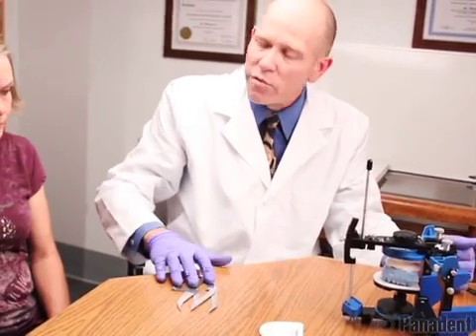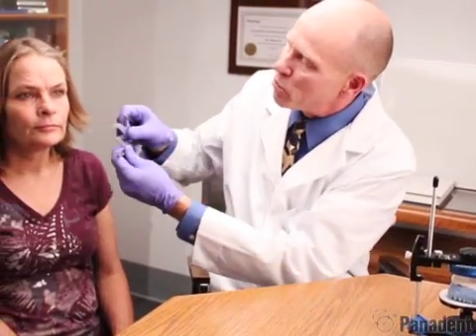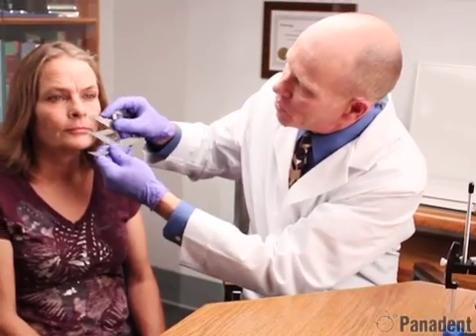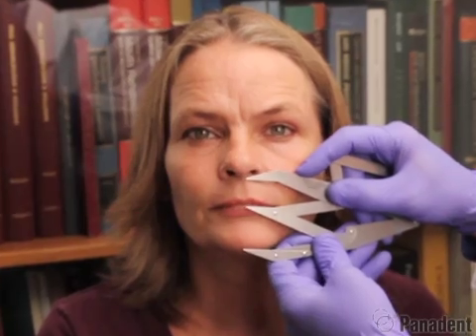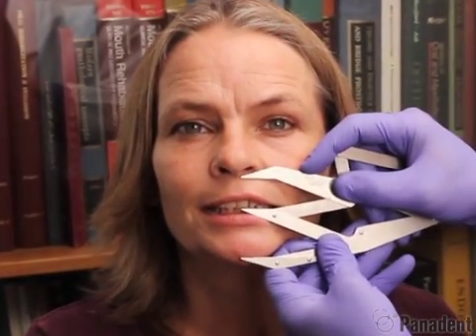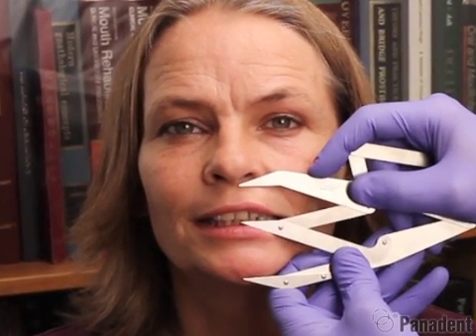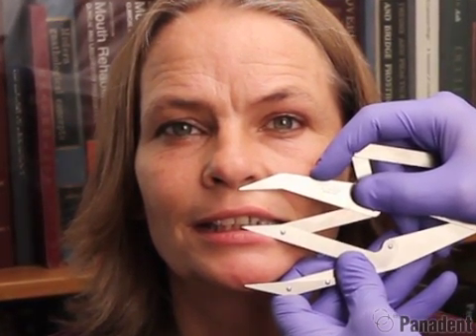We can also evaluate vertical dimension of occlusion by indexing under the nose and smiling just a little bit to the new length of the central incisor. We can see that the vertical dimension is approximately correct, so we may not want to change that.